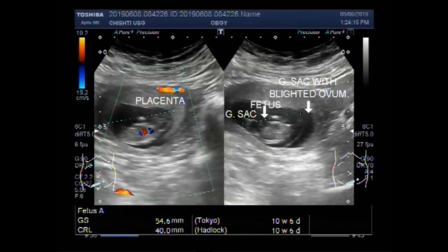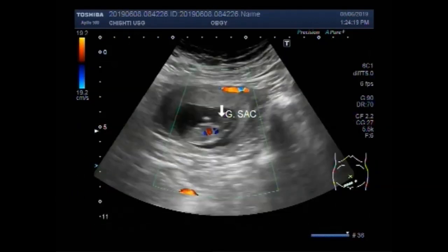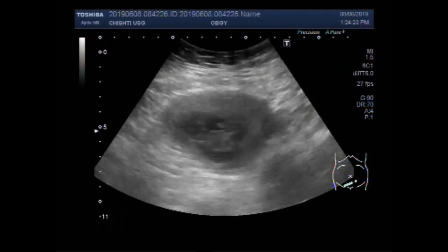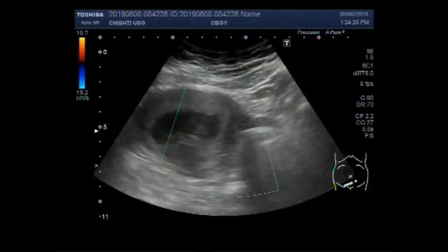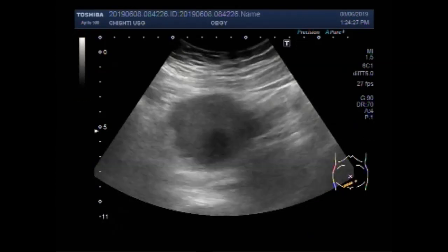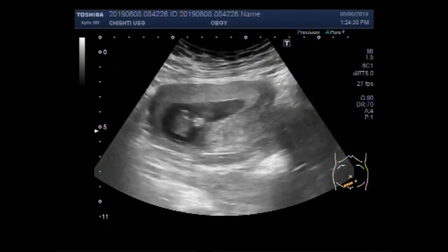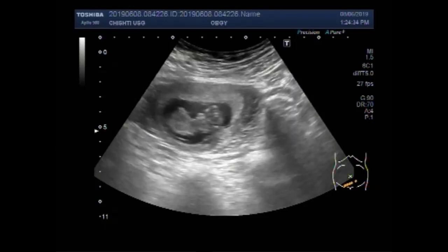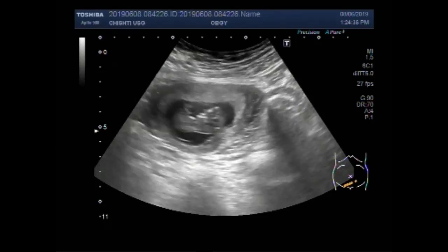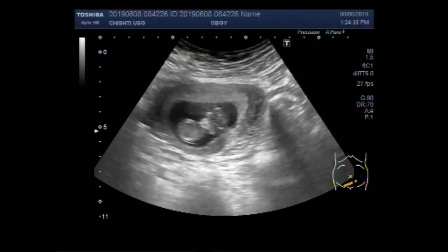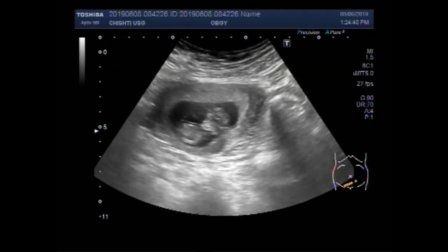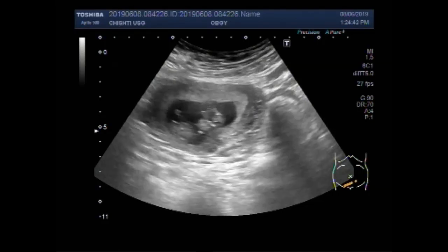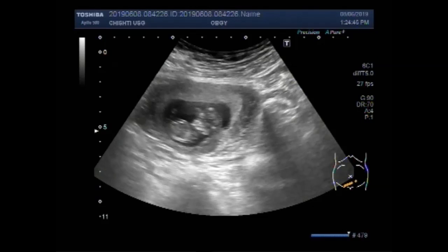Dear viewers, I hope you are all fine. This ultrasound video shows two gestational sacs in the uterus — one normal embryonic pregnancy and the other having a blighted ovum, or anembryonic gestational sac. You can see the normal fetus lying in the gestational sac with cardiac activity.